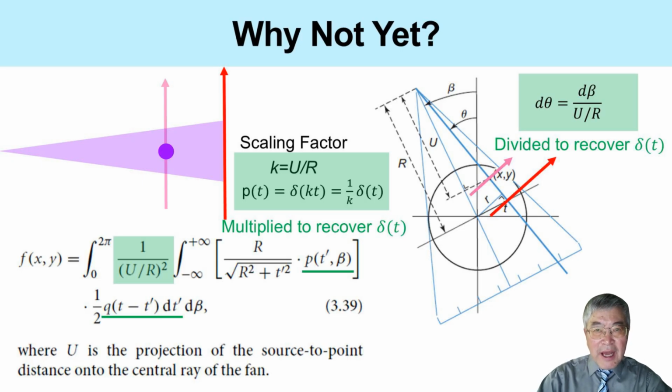Even though both arguments involve the same geometric ratio, they still do not explain the squared weighting factor in the fan beam reconstruction formula, so we need to look one step deeper. We should not only ask what happens to the point object before filtering, we also need to ask what happens after the projection is passed through the ramp filter.